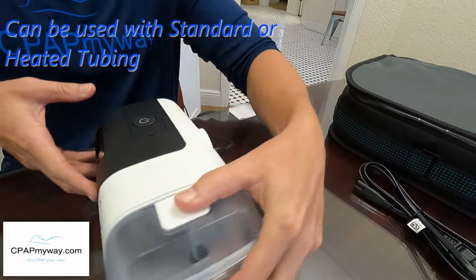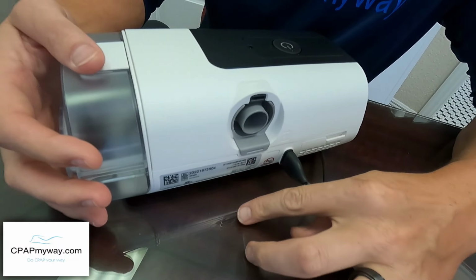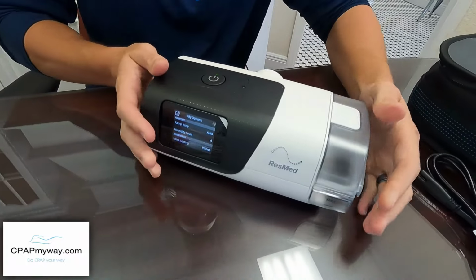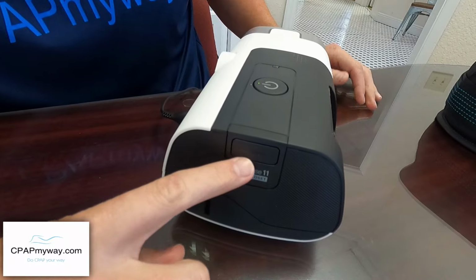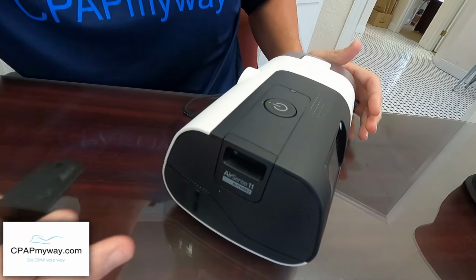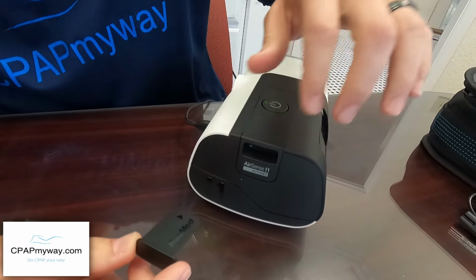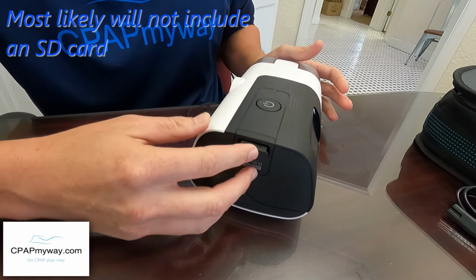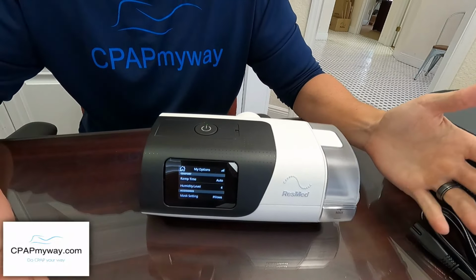So it's got the standard connection on the back, 22 millimeter here. So you can use your slim, you can use your standard 22 millimeter, or you could use the Air 11 heated tubing. On your left side of the machine here, you've got your SD card slot. To get to that, you press this little cap, it pulls out, and you can put the ResMed SD card in there. There's not really a cap for it anymore, and it probably won't come with an SD card, to be honest with you, because of the connectivity options that are in this machine. The SD cards are a little bit irrelevant.